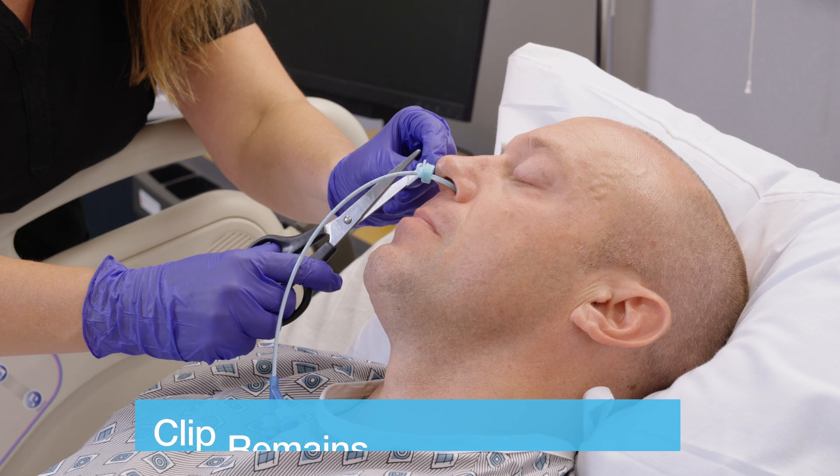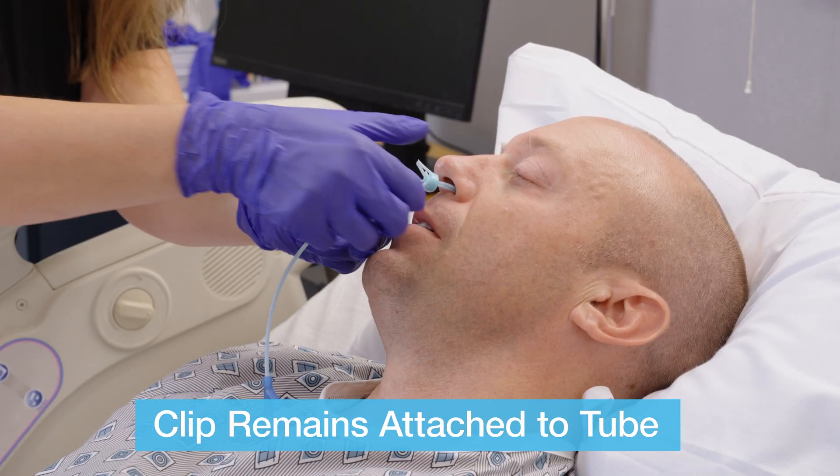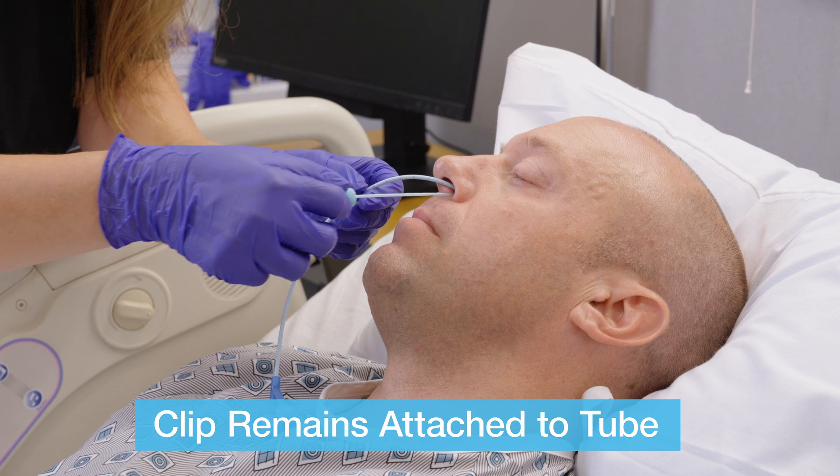To remove the bridal pro, cut one strand of the bridal tubing. Gently pull on the bridal pro to remove the device.